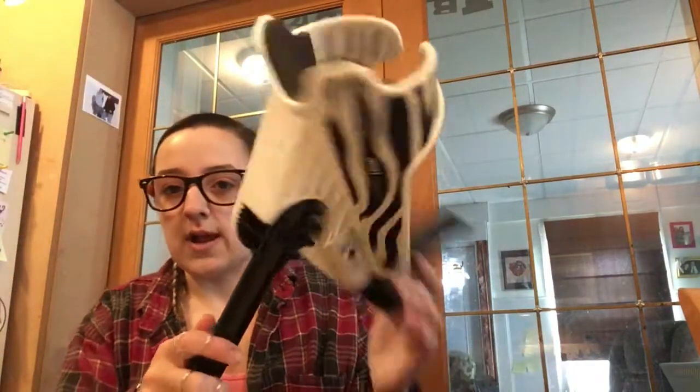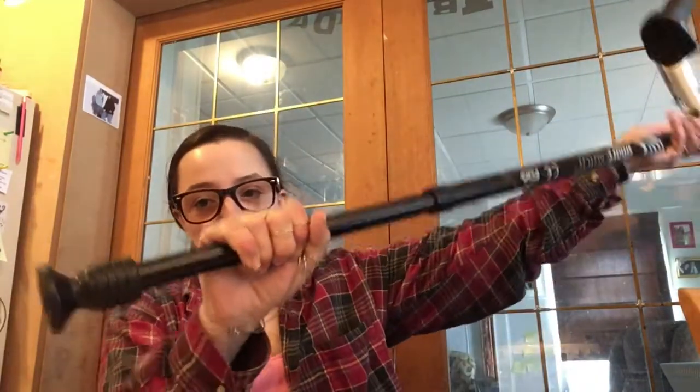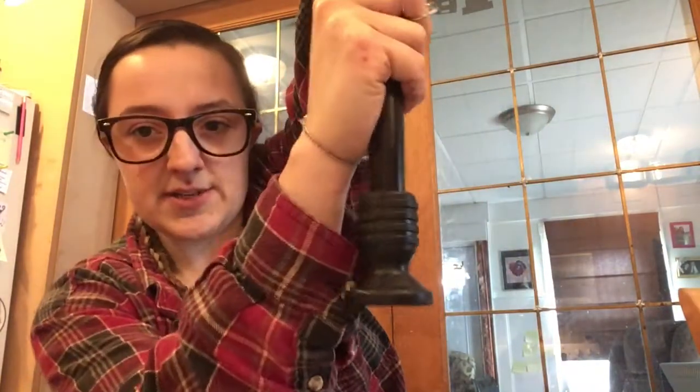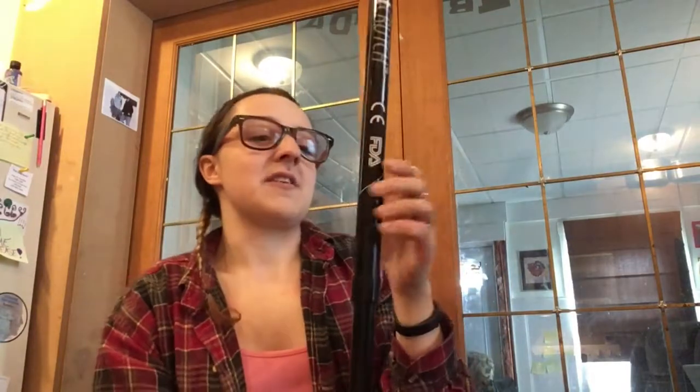I've set them up a little bit, and I've played around enough so that I can tell you a little bit about it. Even the crutch tip is interesting, too. That's unique, too. I don't know if you can tell, but when you put it down and you bend it, it stays pretty on the ground. So, don't mind me, parents, putting crutches on the counter.